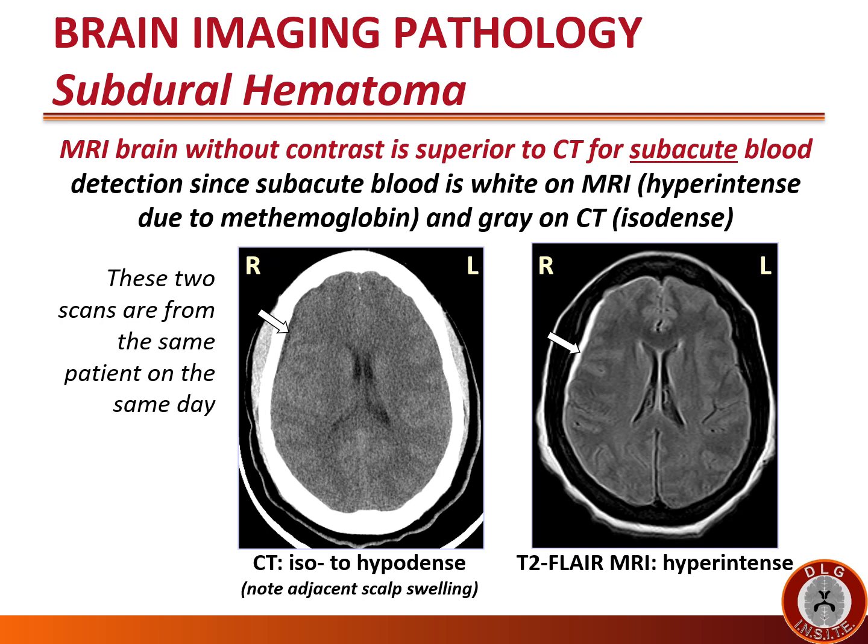MRI brain can be very helpful for detecting subacute subdural hematomas. MRI brain without contrast is actually superior to CT for subacute blood detection, as subacute blood is white or hyperintense on MRI due to methemoglobin, but gray or isodense on CT. Looking at two scans from the same patient on the same day: the CT scan barely shows the iso-to-hypodense subdural under the scalp swelling in the right hemisphere, whereas the MRI FLAIR more clearly shows the hyperintense subdural hematoma on the right.